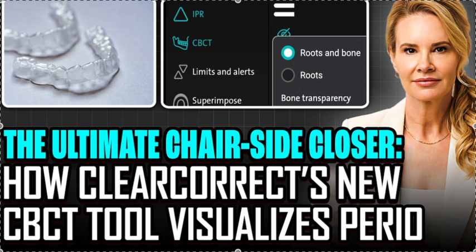So I still think Invisalign's is superior. And of course, this is better than Spark's in my opinion. So I would say Invisalign takes the A+, ClearCorrect takes the B, and Spark takes the C. And if there's any other ones, y'all can show me.